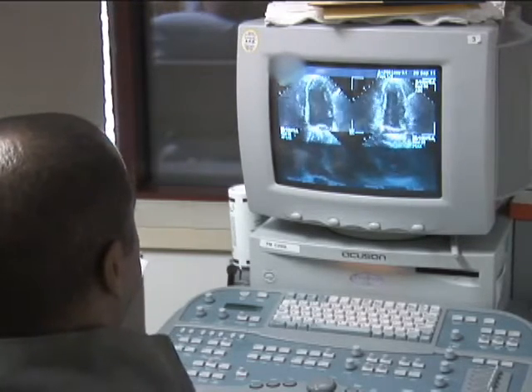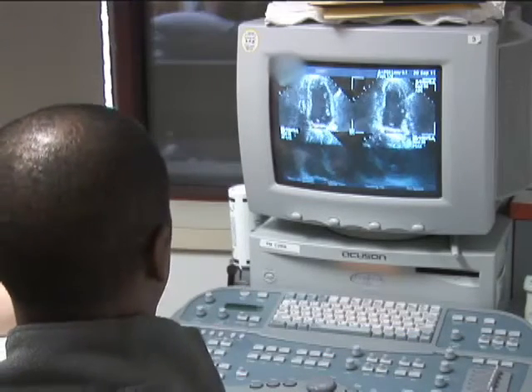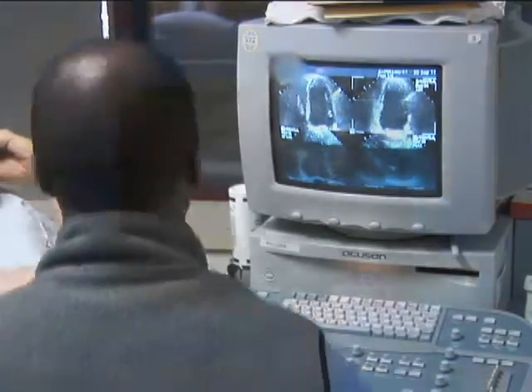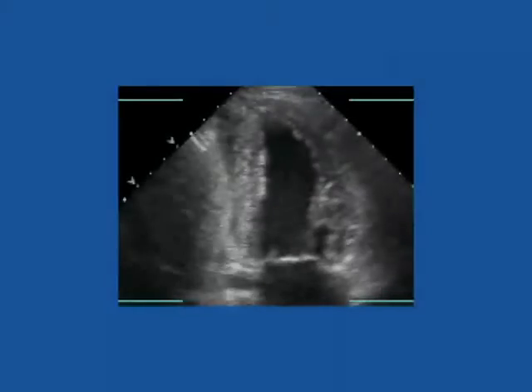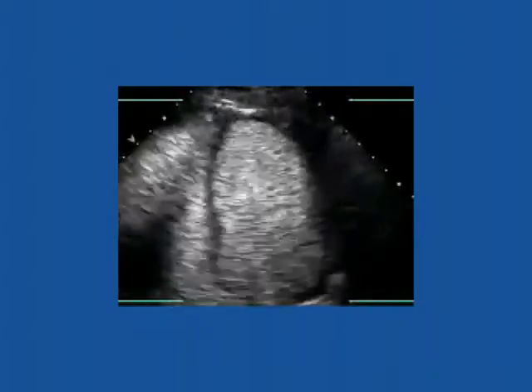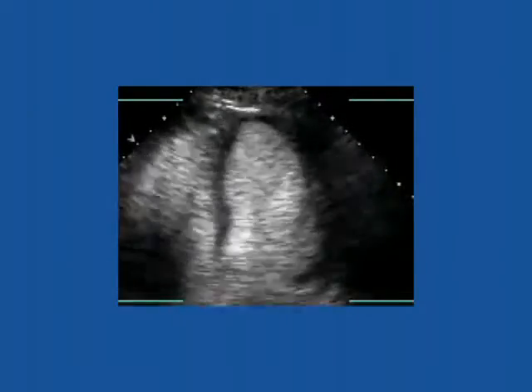The ultrasound system is set up for recording images in a stress testing format. This allows echo images taken at rest and following peak stress to be displayed concurrently side by side to facilitate comparison. Images are acquired in standard image planes, typically the apical 4-chamber view, apical 2-chamber view, apical long axis view, and the parasternal short axis view. Recording the parasternal long axis view also may be helpful. If image quality is poor, this study can be performed concurrently with transpulmonary microbubble echo contrast to aid in left ventricular endocardial border definition as shown in this example.